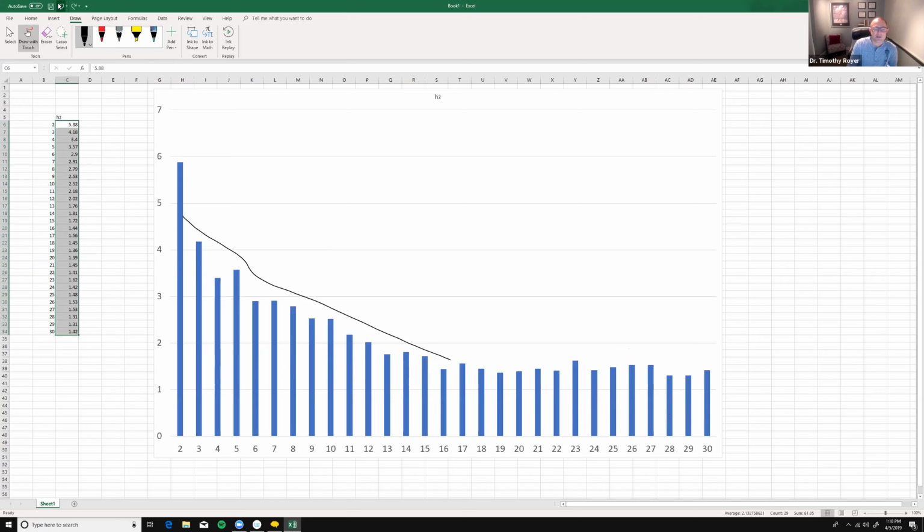When it comes to the volume of theta, which is 4 to 8 hertz, compared to the volume of 16 to 20 hertz, which is low beta, if I take the theta and put it over top of the 16 to 20 hertz, that ratio of those two volumes, the heights, the amplitudes, in a mathematical formula, the ideal spot is 2.4. That would be the ideal distribution of those brainwaves.